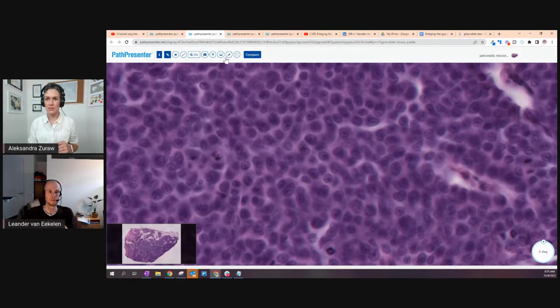So let me do a quick demo. I have to click more than I should, but let's do object detection. Does it make a dot? I would just want a dot. We could just make a little line, and I just go and draw a line on each of them, and that is my object detection. Exactly. You have basically clicked in the middle of the cells, and you have noted that there's an object right there. So let me do semantic segmentation of the nuclear region. I'm making some funniness here, but let's say I'm annotating a nuclear region.